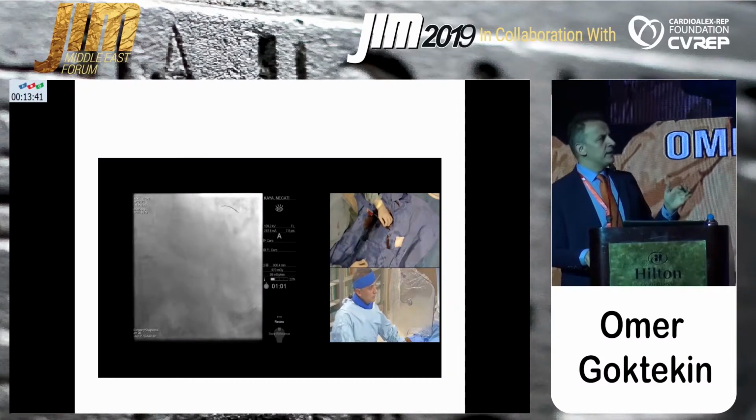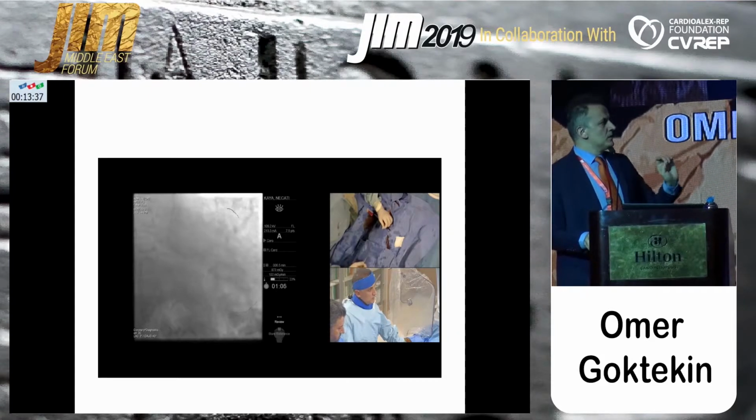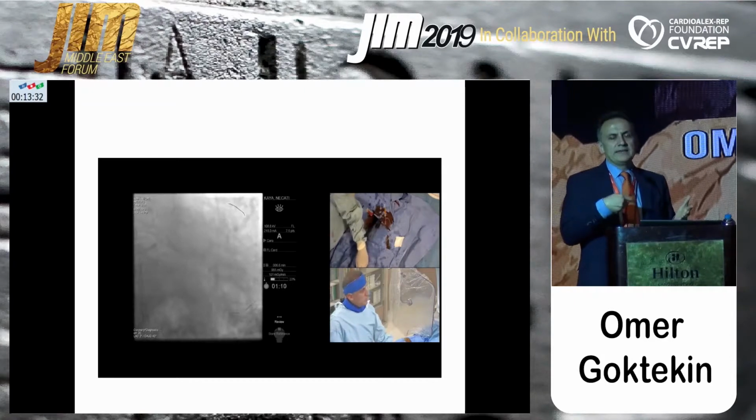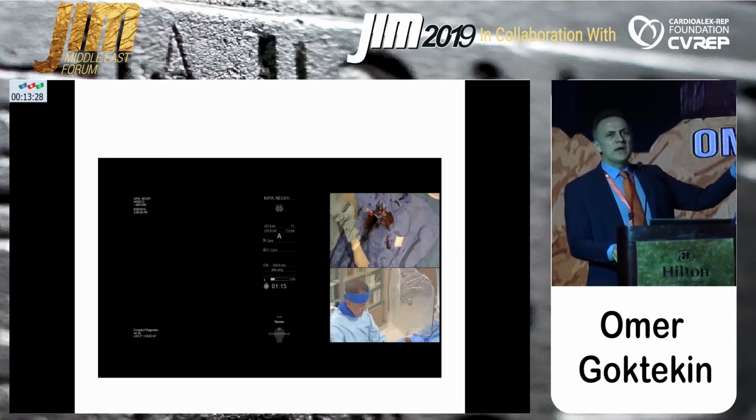Most of the time, we have nice fine balloons. Mostly they cross easily. So at this time, of course, I had to use this over this Pilot 50 because I couldn't change it yet. Now I will remove the microcatheter.